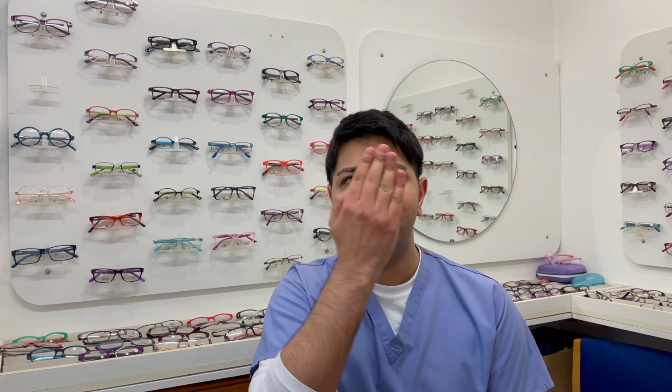So after washing my hands and using my mirror to insert the lenses, what are my initial thoughts? Well, they both feel very similar in all honesty at this stage. However, as I've said, they've just gone in. My vision seems fairly clear and equal at this stage. My eyes obviously look white because they've currently gone in and they don't particularly feel very dry. So I will continue wearing them throughout the day and keep you posted about my progress in terms of a user experience.